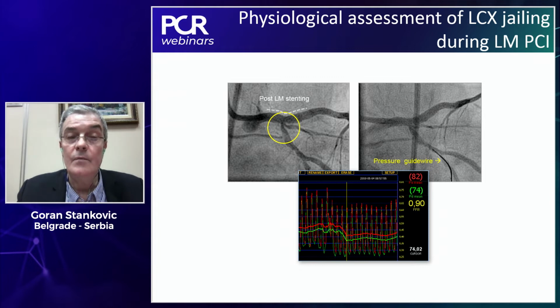In addition, what we have with post-dilatation of the stent in the main vessel is overexpansion and overstretching. So we have oval shape deformation of the ostium of the side branch, in this case of the circumflex. This oval shape overexpansion will actually preserve the area, so a physiologically negative result, like in this case 0.9 for FFR, could be found with a very tight angiographic appearance of stenosis.